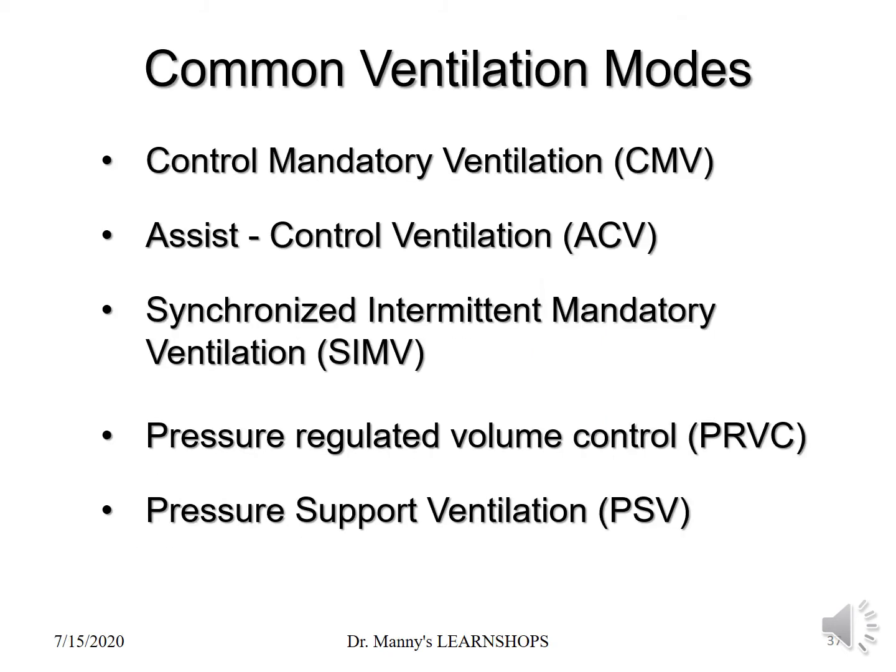What are some of the common ventilation modes? Control, mechanical or mandatory ventilation. Look at the words. Ventilator's in control, mandatory ventilation. Machine's in control. Assist control ventilation. Patient only assists a little bit, mainly control.